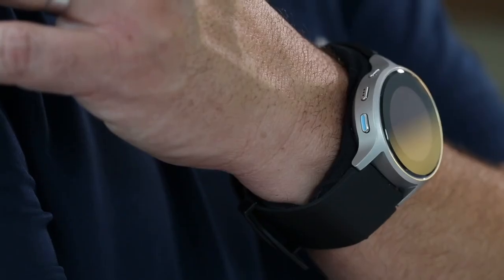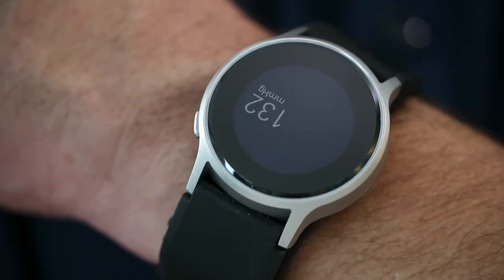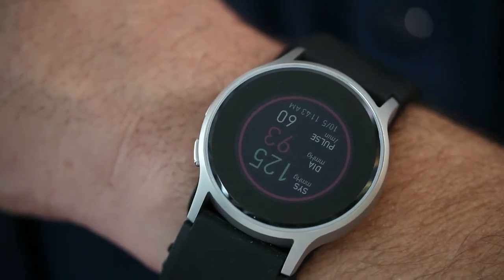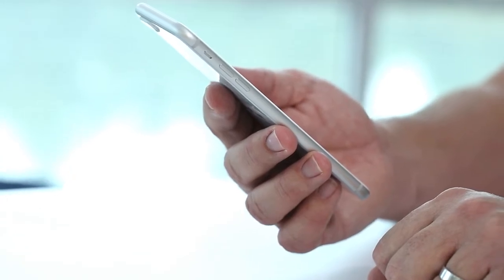During this process, it's important to keep the watch still. Do not move, turn your wrist, talk, or look at the watch display while the cuff is inflating, as it may affect your results. Once the measurement is complete, the watch will emit a light vibration. Results can then be transferred to the Omron app for further review.